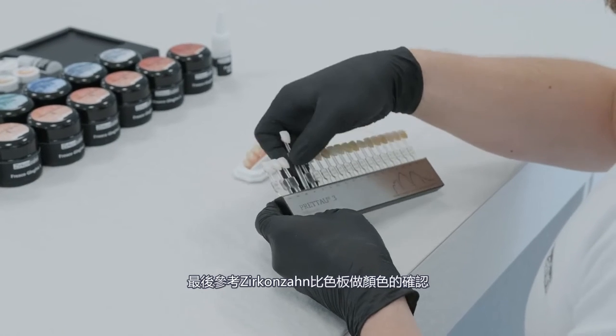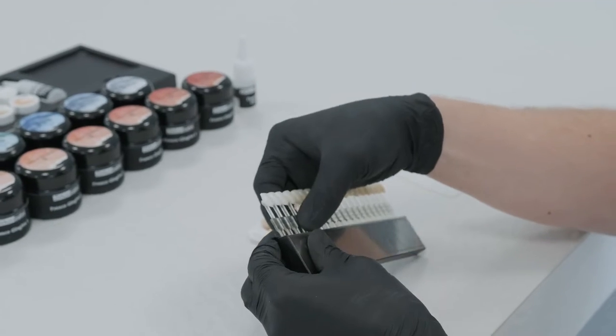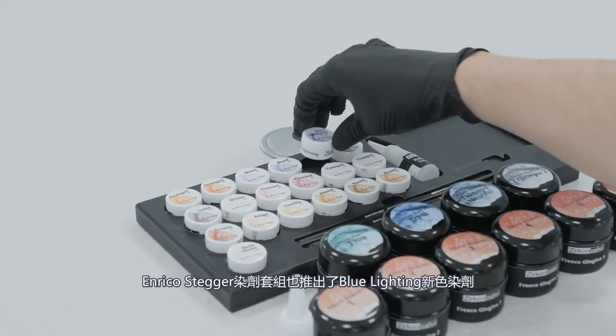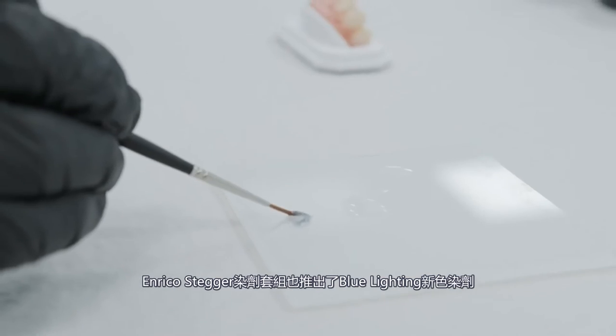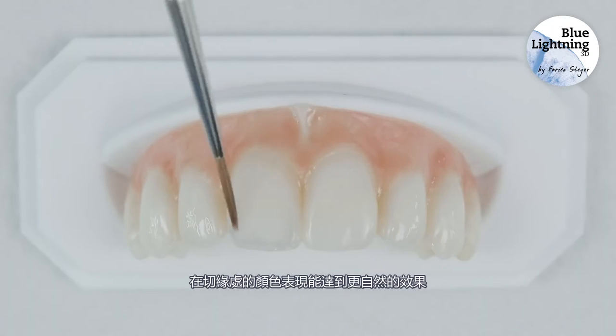The Zirkonzahn Shade Guide is then used to check the shade. With the new Blue Lightning Shade from the Ice Stains 3D by Enrico Steger collection, the incisal edge is shaded to recreate a natural effect.